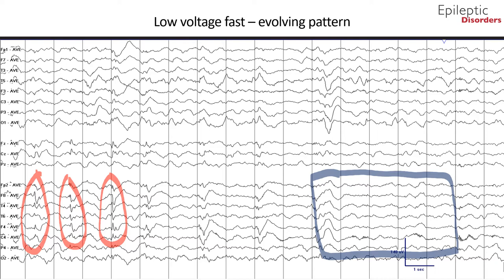This seizure from start to finish experienced evolution in morphology and frequency of waveforms, with initial low-voltage fast activity progressing to higher-amplitude delta activity and ending with clear rhythmic epileptiform discharges. It was localized over the right frontal region and had spatiotemporal evolution with involvement of regional frontal midline, right temporal, and central electrodes, ending with focal post-ictal slowing greatest in the right frontal region.